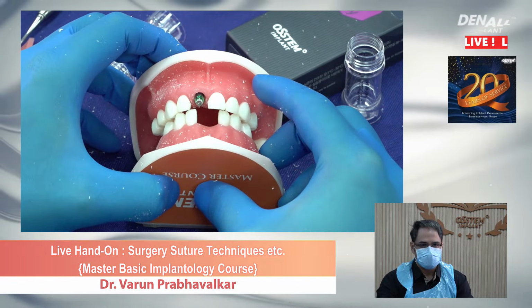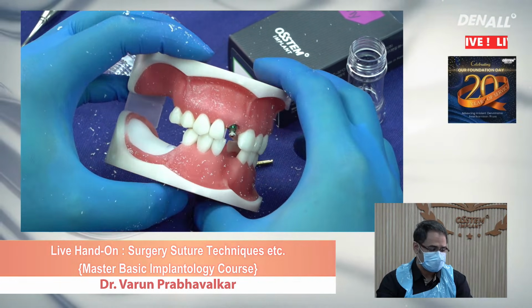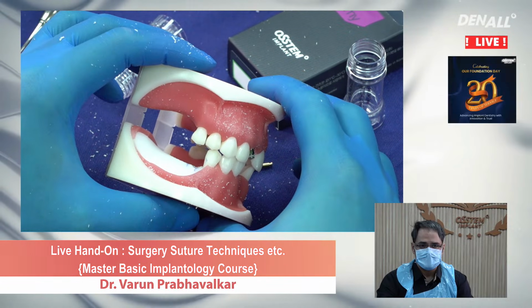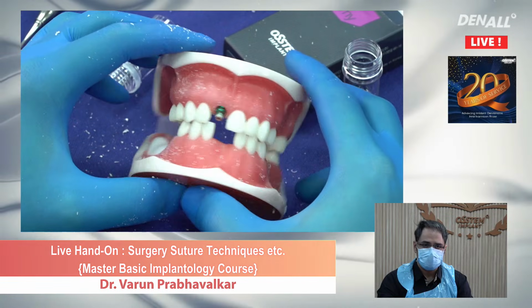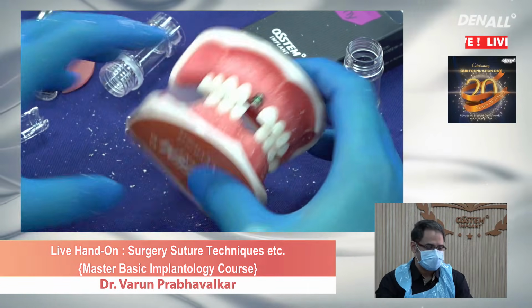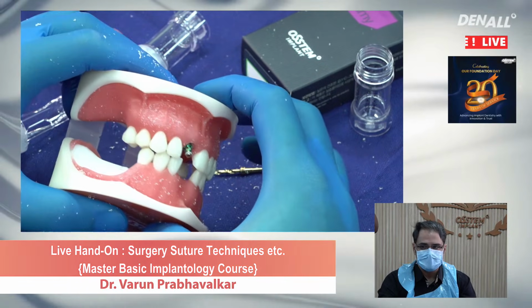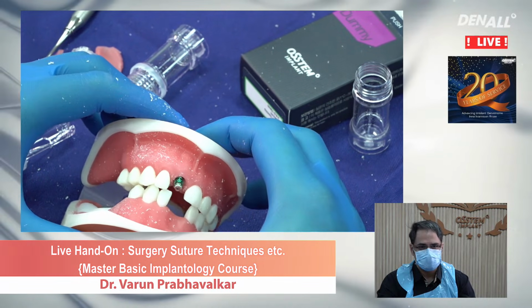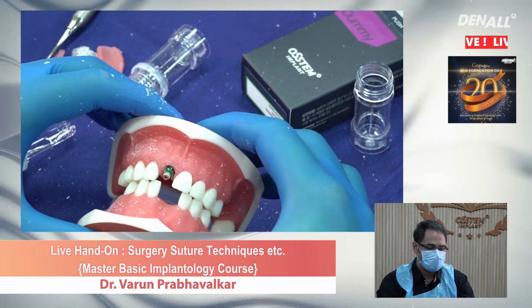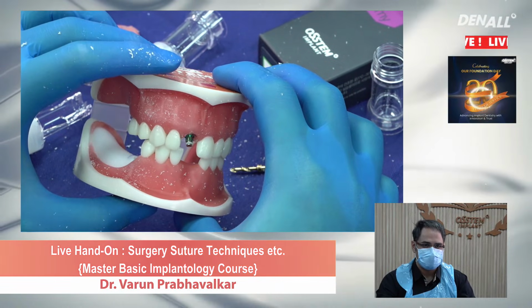Here you go. Okay, these are the two basic exercises for the basic level master class, and right now our students are going to perform the same exercise. Some of them are really new, some of them have never placed an implant, but I believe it would be a very learning experience, and it would be fun to place implant on the model like that.